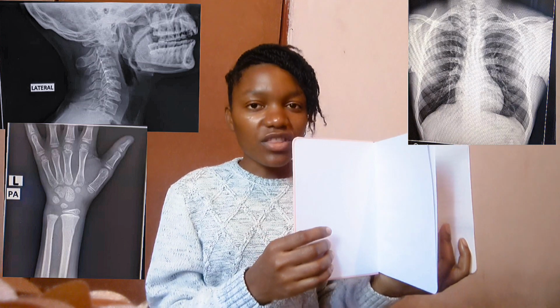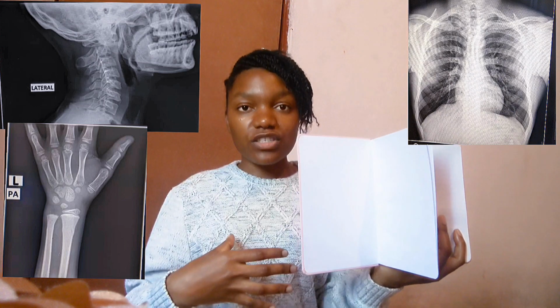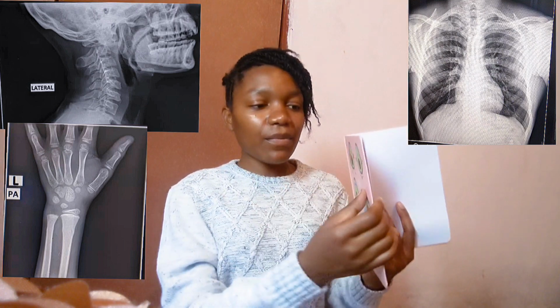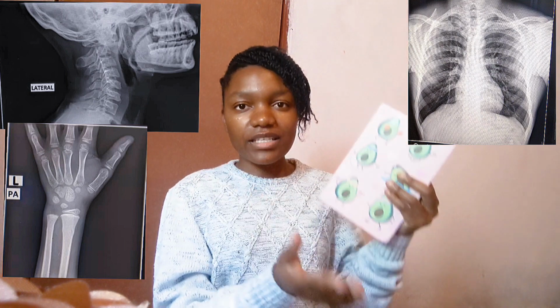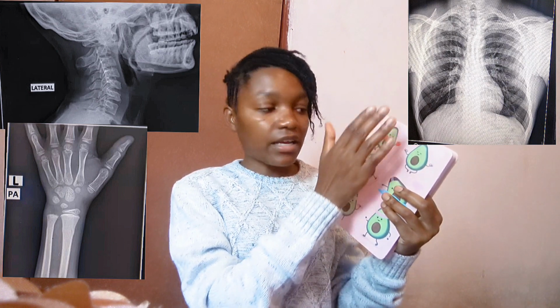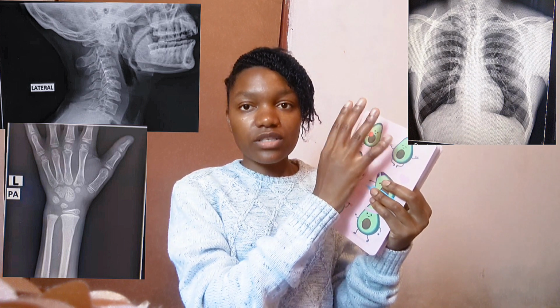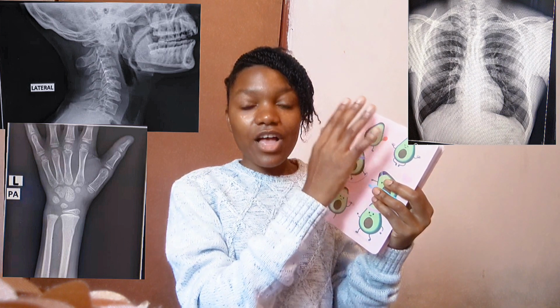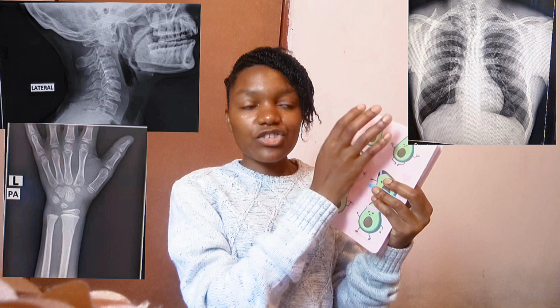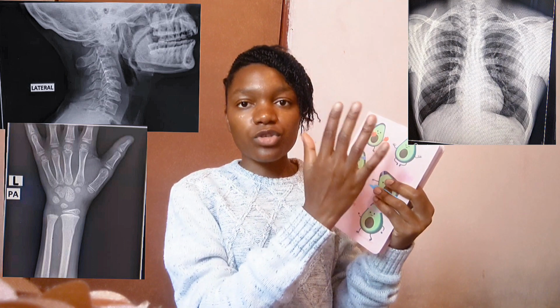By the way, let me mention this. An x-ray is just a shadow of a patient, right? So for example, this is my hand, this is the notebook. I don't know if you can see that shadow just behind, in front of this. There is a shadow there which is being created by my hand. So the x-ray image is just the shadow of an object or the patient. That's how it's created, right?